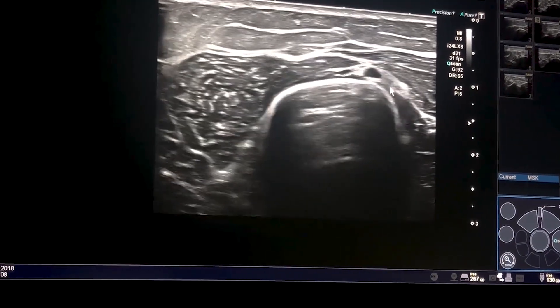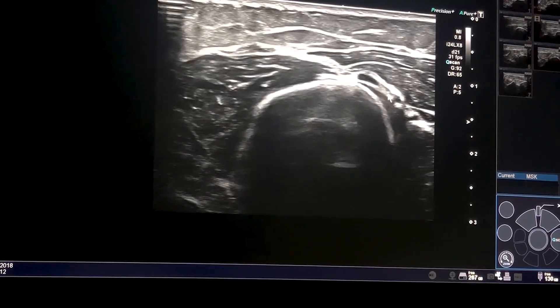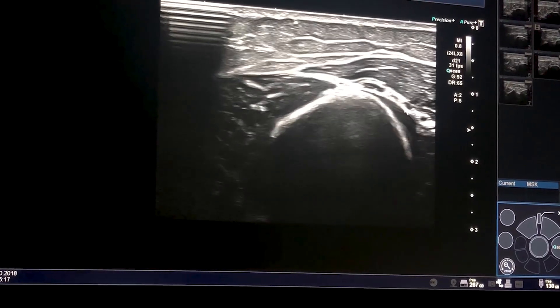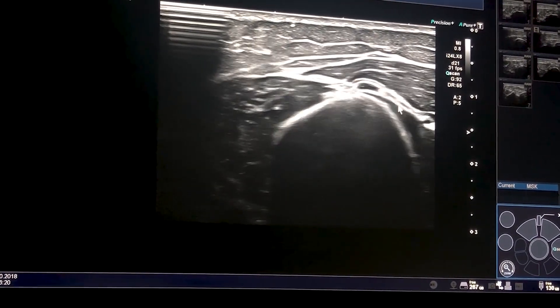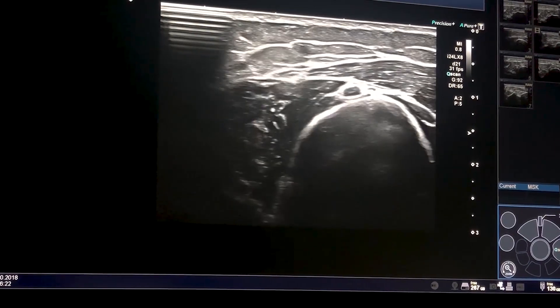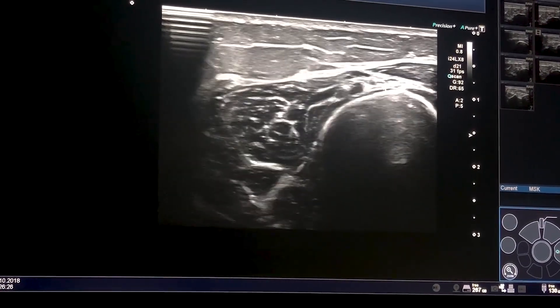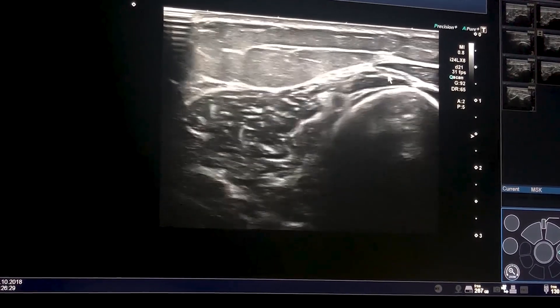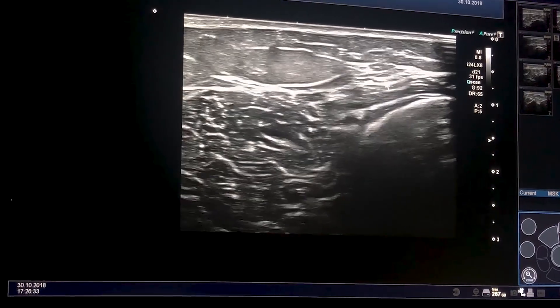Going more cranially, we can see the fascicles of the posterior cutaneous nerve close to the radial one. This is the deep humeral artery — so deep humeral artery, posterior cutaneous nerve, radial nerve — and then we see the posterior cutaneous nerve as it diverges from the radial nerve, moving down into the subcutaneous tissues.